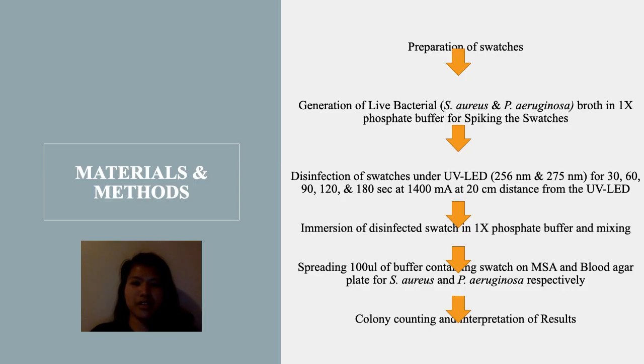For our materials and methods, the first step we did was to prepare our bacterial suspension with phosphate buffer. We did this according to the McFarland standard for both microorganisms. And after this, we spiked our personal protective equipments with both organisms and for the two different wavelengths.